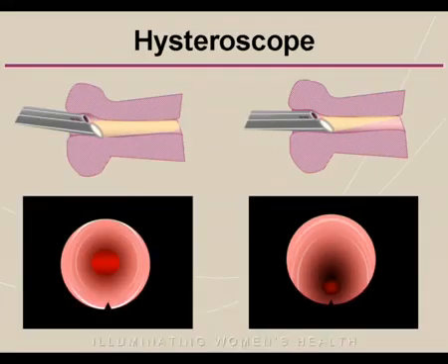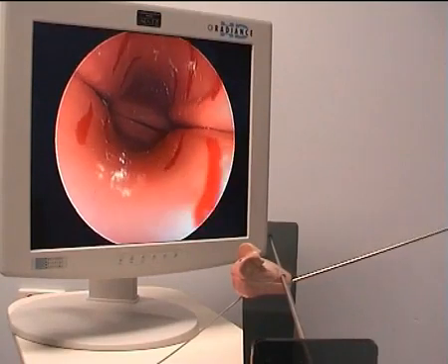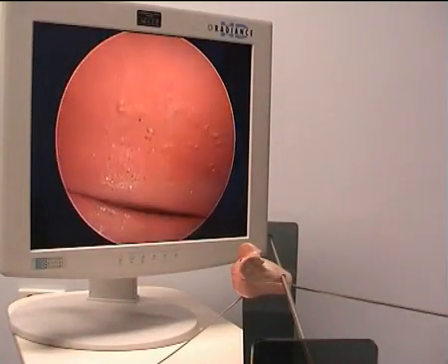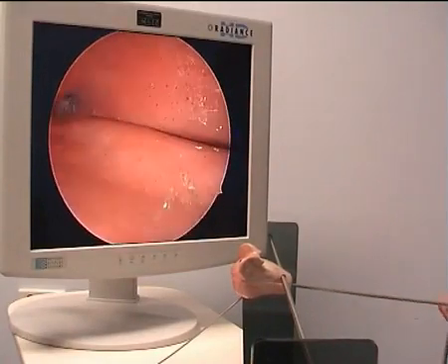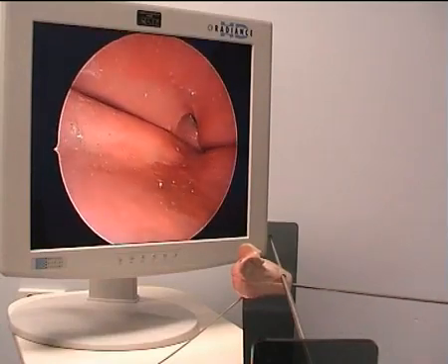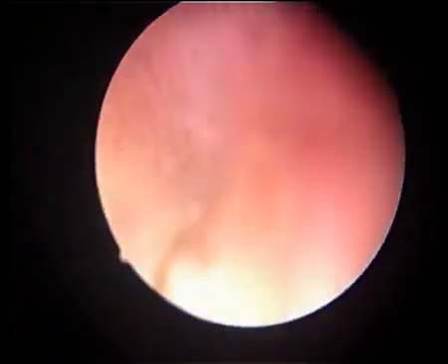This feature of the hysteroscope is essential for visualization of the entire uterine cavity, but can create difficulties negotiating the cervical canal if mechanical compensation for the angled view is not made. Hence the scope can only be advanced coaxially through the cervical canal if the screen image of the canal is located at the 6 o'clock position on the screen.